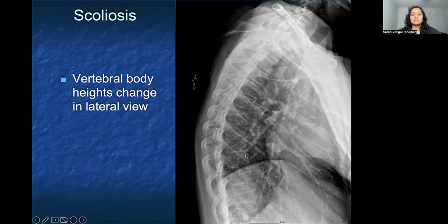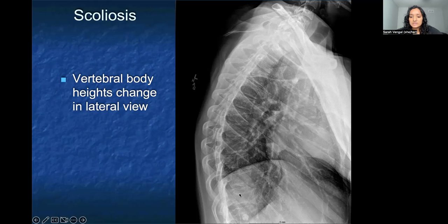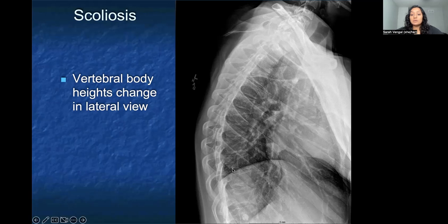When looking at a lateral view of someone with scoliosis, you actually change the way you're seeing the vertebral bodies. Down lower, you can see one part of the vertebra and the back side of it, so it looks as if that vertebra is actually turned toward you and you can see the top of it a little better. Don't be fooled into thinking the vertebral body height is less than the ones above it — it's actually from scoliosis, and you're seeing a different angle of that vertebral body rather than an actual loss of height.